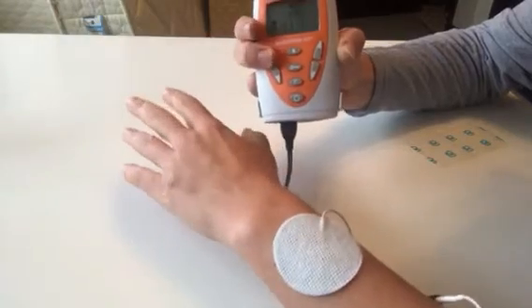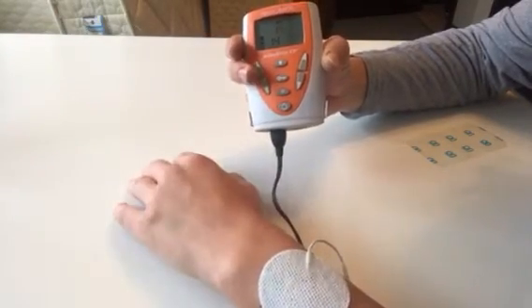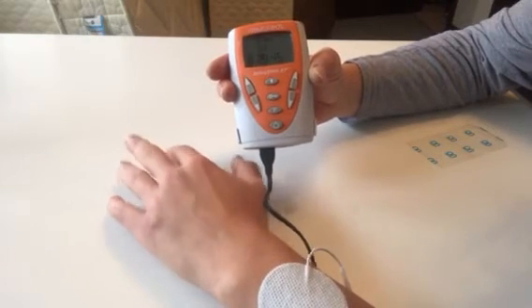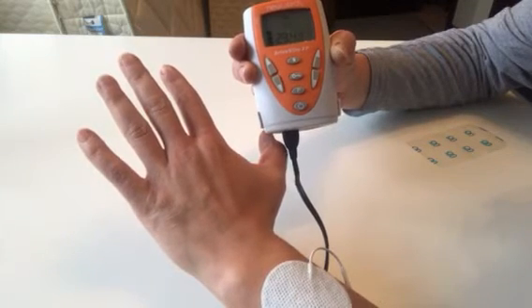As I increase that intensity, you can see my wrist respond. The timings are set — I've got a rest period and a stimulation period, and this will run for 30 minutes.